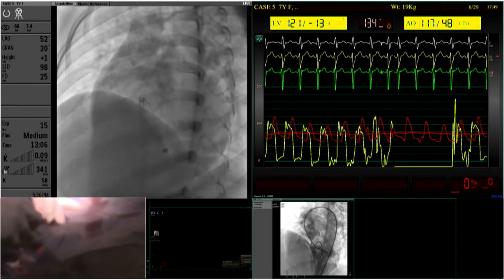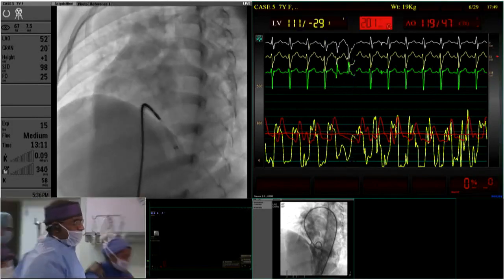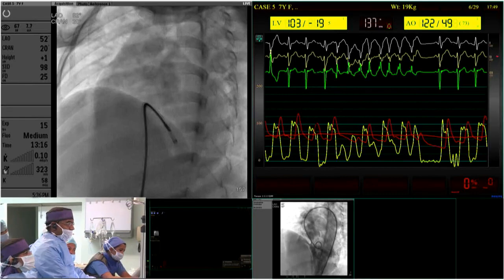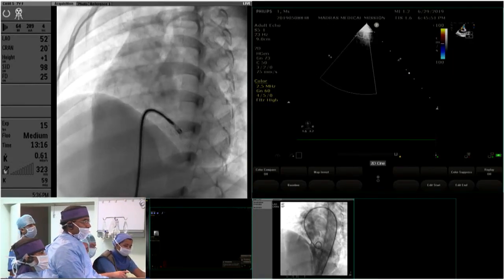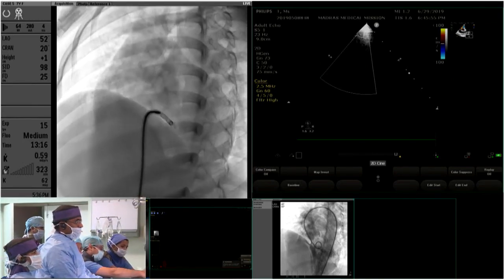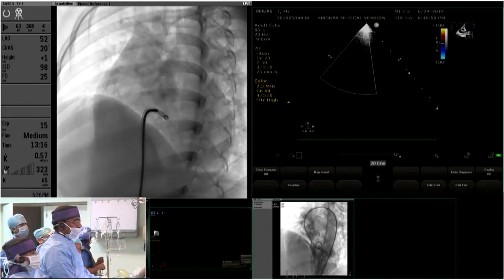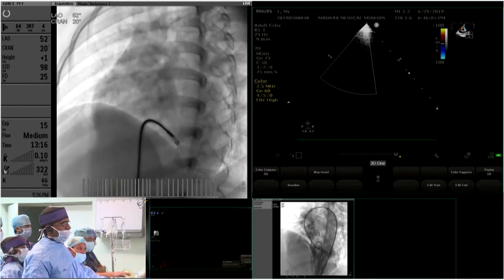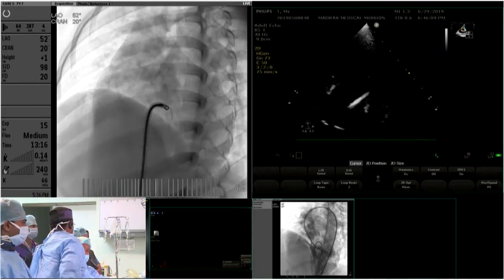So currently what we are doing is the catheter is recording LV pressure. I slowly open out. This device is not seen so well, so I am going to use some fluoroscopy. So it looked like Dr. Srija was telling it is in some chordae. Oh no, it is not. Can you show me the echocardiogram where we are? Apical four chamber. See, I want a proper picture.